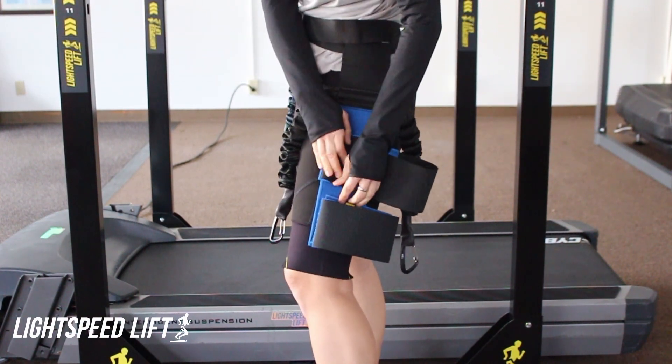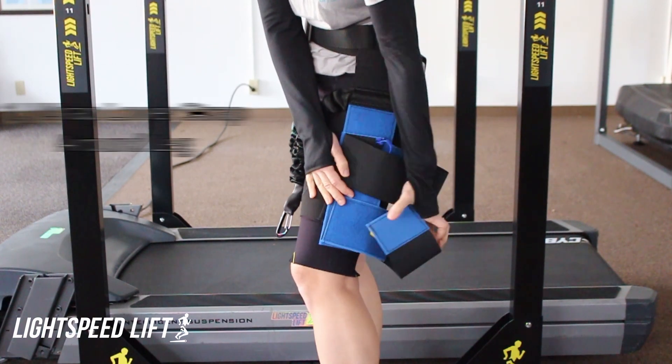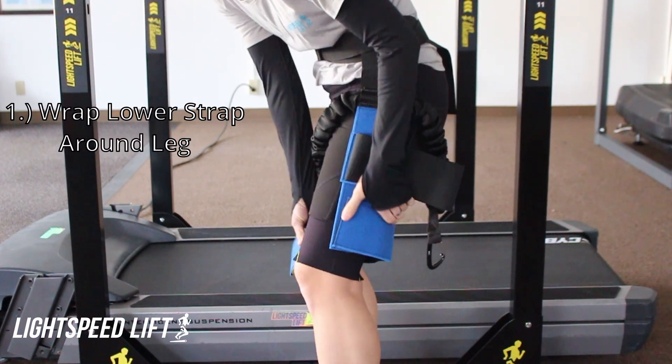First off, you'll take the lower strap, wrap that completely around your leg, just above the patella.